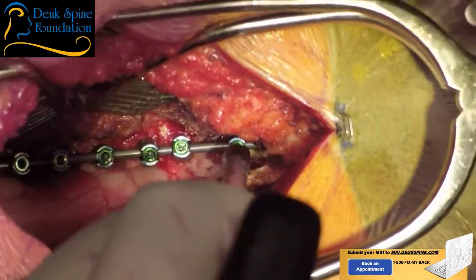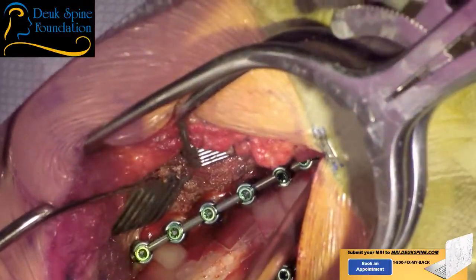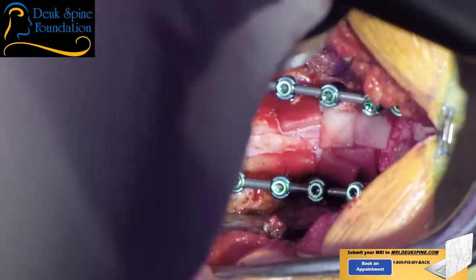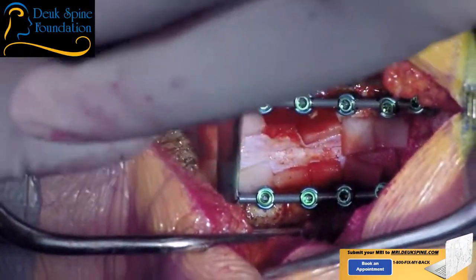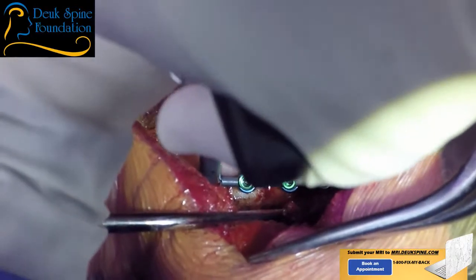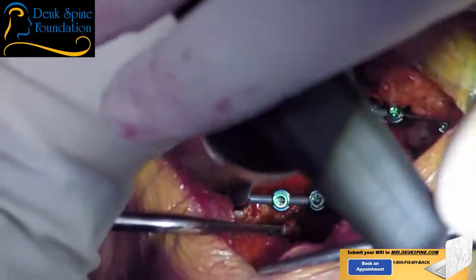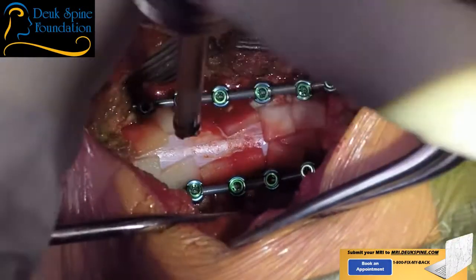Last one on the right. Sean, any questions? We're going to be closing soon. We have our grafting to do, and then we're going to close. No other questions. We got irrigation. By the way, if you're wondering, that is the dura and the spinal cord, folks. The cervical spinal cord. Y'all see that down there? Sean, view good? Yes, it's just when your hand's in the way when you're screwing, that's all.